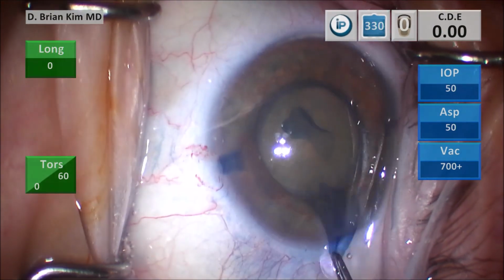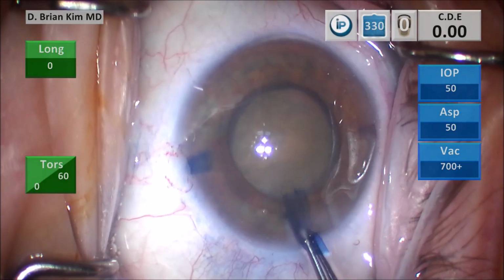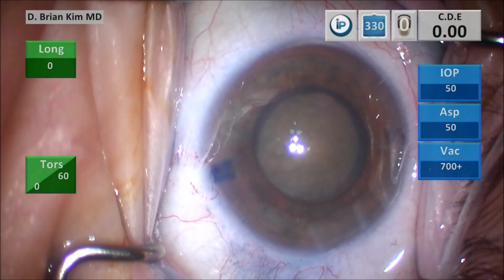All right, so now we finish off the rhexis. Burp some viscoelastic out of the eye. I'm grabbing that little tag of capsule. This is the capsular fornix hydrodissection technique.